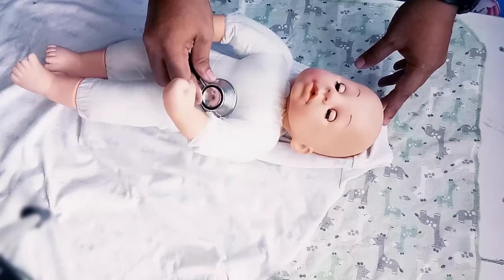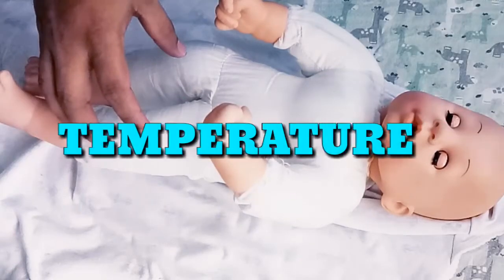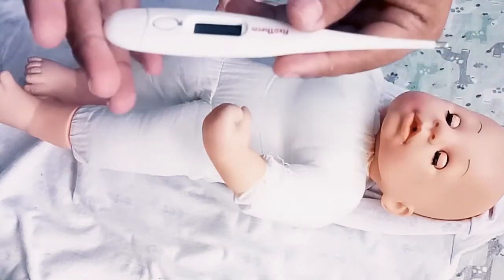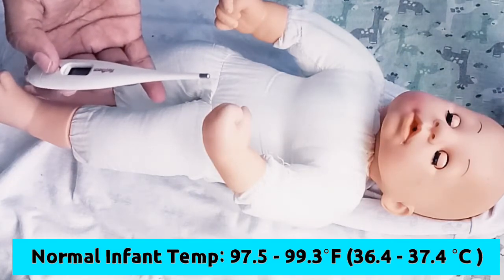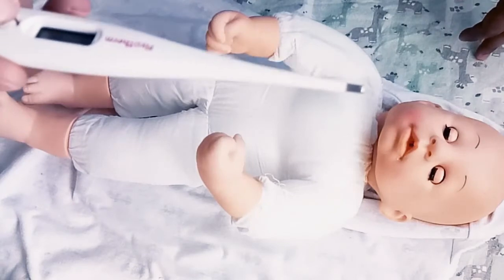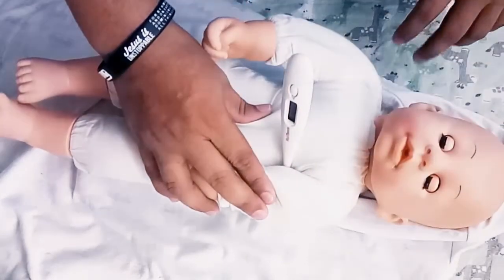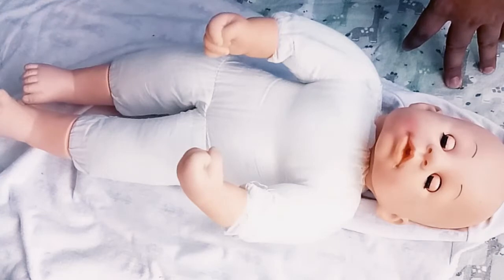Our infant heart rate is 142, which is normal because the normal rate is 100 to 190 beats per minute. To check the temperature of the infant, we're going to check via the axillary route — we're going to place a thermometer in the infant's armpit. We're going to use a digital thermometer. A normal temperature of an infant is anywhere between 97.5 to 99.3 degrees Fahrenheit. Place the thermometer deep inside the armpit, then put the arm down and wait for the thermometer to beep. When it beeps, it's done. The reading is 99.1 degrees Fahrenheit — the baby has a normal temperature. We will document it.